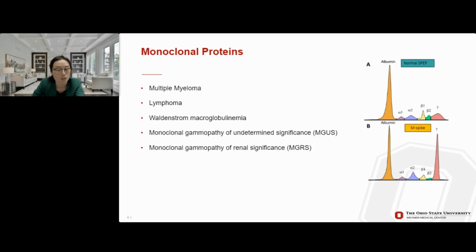Talking about protein electrophoresis, we need to understand the clinical use of this technology. The technology of protein electrophoresis is used mostly to detect monoclonal proteins. Monoclonal proteins are complete immunoglobulin molecules, or fragments with the same amino acid sequence, secreted by clonal plasma cells or B lymphocytes.